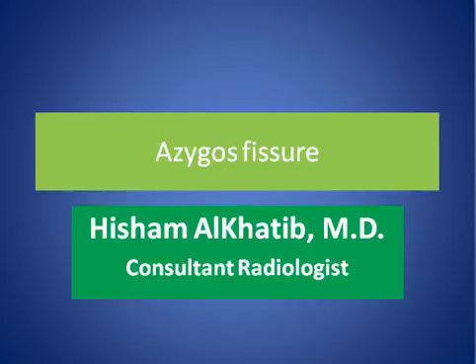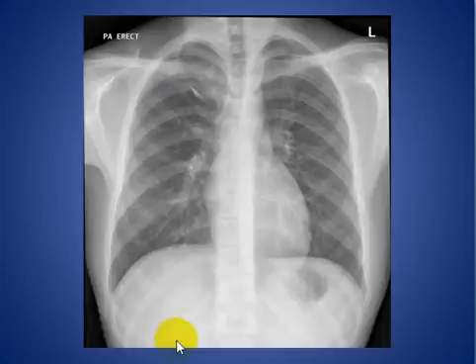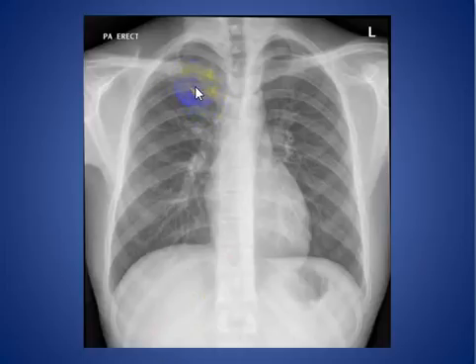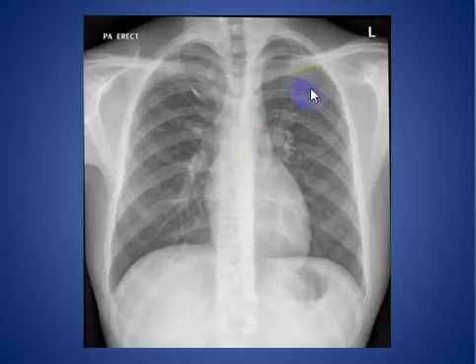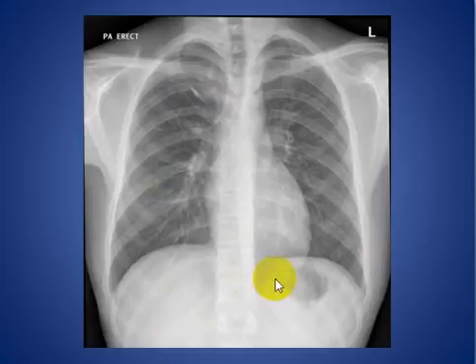My topic today is about azygous lobe and azygous fissure. This is a PA chest x-ray showing the azygous lobe and fissure. This is the normal cardiac size, lungs are clear and no pleural effusion seen, with an unremarkable bony cage of the chest.